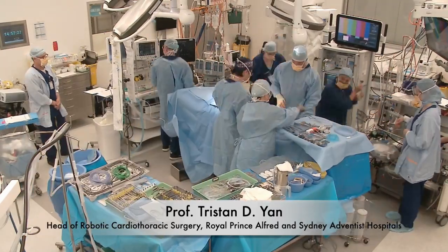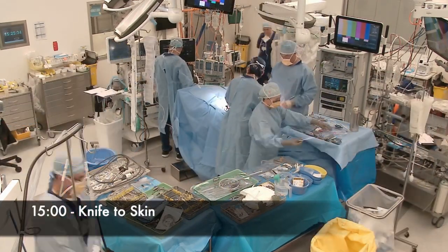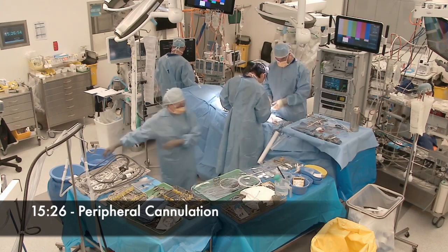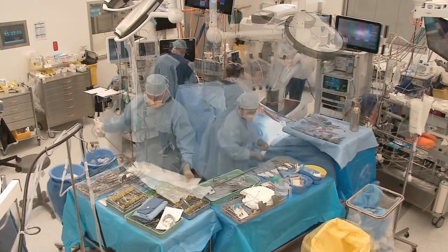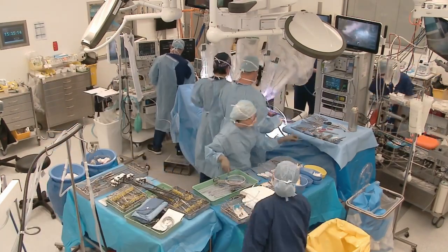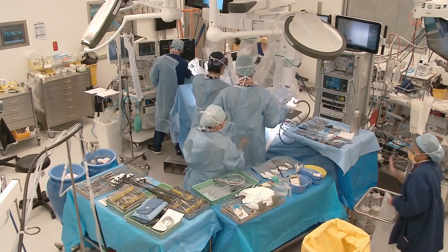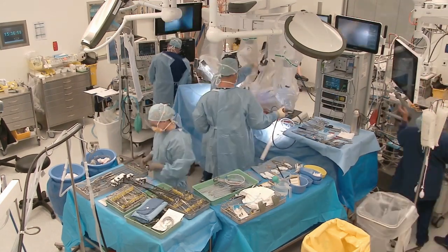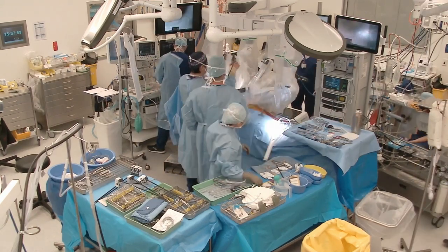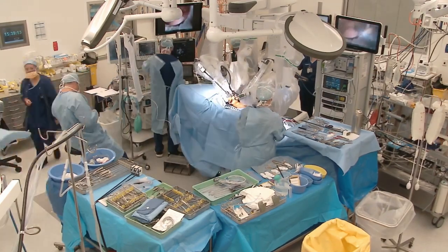I've decided to show you a case that will be considered run-of-the-mill for our robotic surgical team on any given day. This patient has severe mitral regurgitation due to ruptured cordy of the P2 segment. I believe this case illustrates a simple repair technique that is efficient and reproducible. A big part of our team's pursuit has been to continuously improve our economy of motion at all stages of the operation, and we have seen outcomes steadily improve over time.